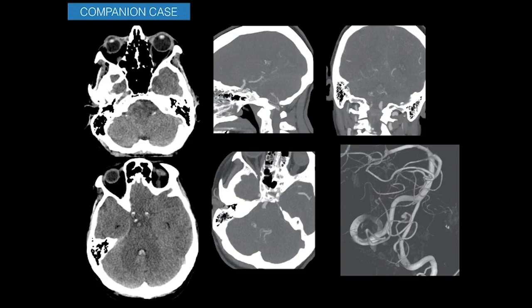In other cases, aneurysms may not be as apparent. In one companion case, the subarachnoid hemorrhage itself was subtle — some blood along the right perimedullary cistern extending into the foramen of Luschka and fourth ventricle. CT angiogram showed no aneurysm at the PICA origin, but distally within the cranial loop of the PICA there was a small dissecting aneurysm demonstrated on DSA. If not identifiable on CT angiogram, digital subtraction angiography must be performed.